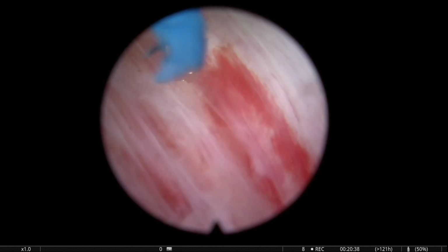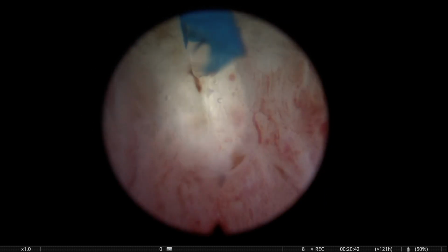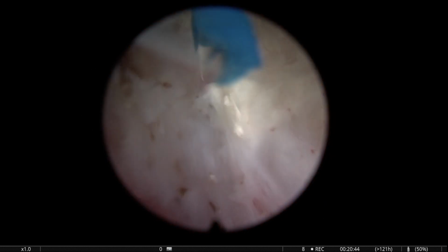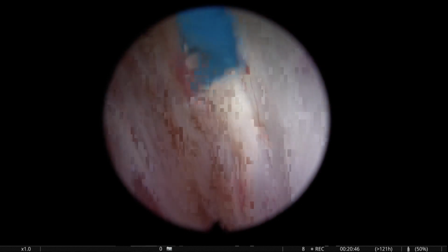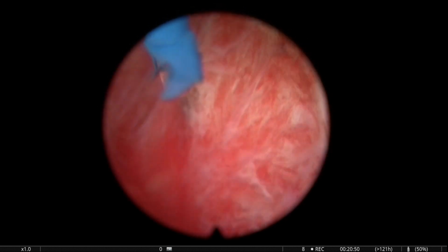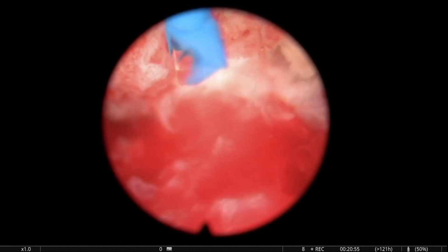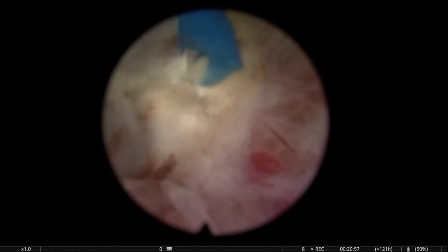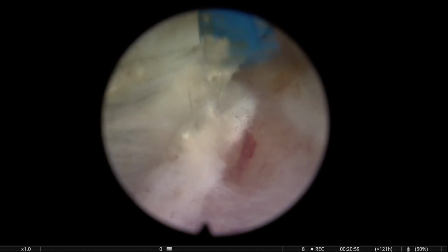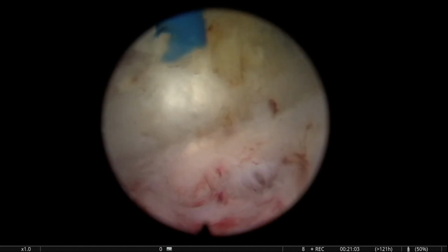We're now 20 minutes inside the procedure. You see that the line circumferentially surrounds the adenoma. We have a satisfactory plane now, and that's a little bit of hemostasis because you don't want to accumulate too many vessels bleeding at the same time. So there we are, trying to follow this line again. You see, we follow this line. We try to connect with what we had on the other side.